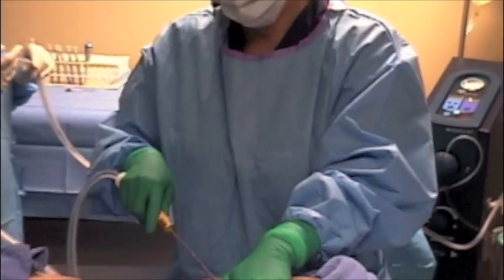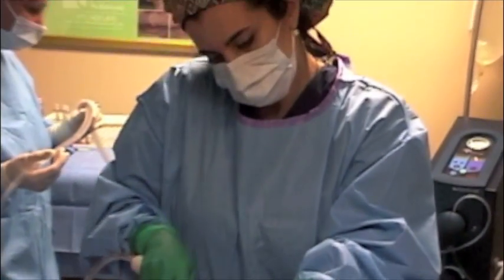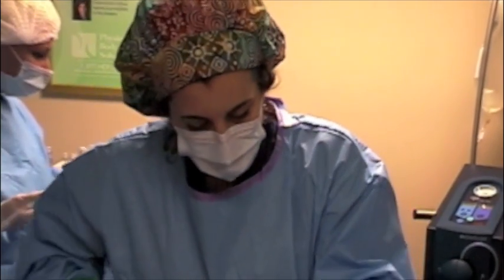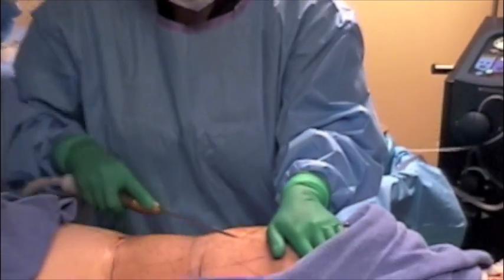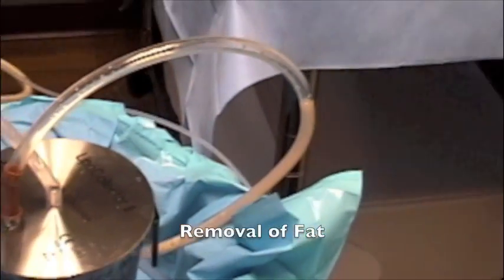Okay. Perfect. Notice how pure the fat is, how little blood there is. It's pure yellow. It's 90% vital.